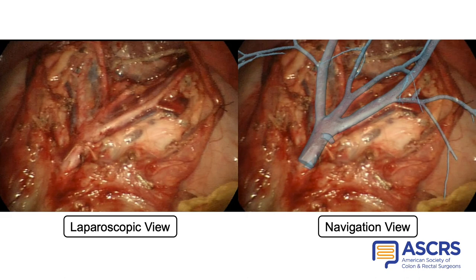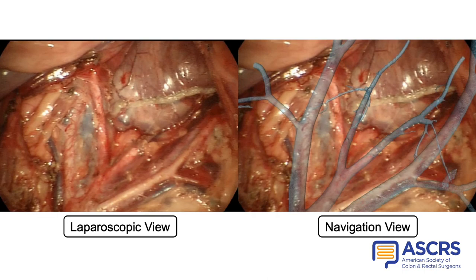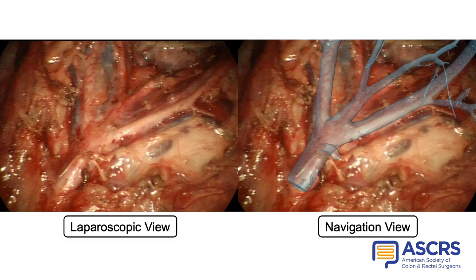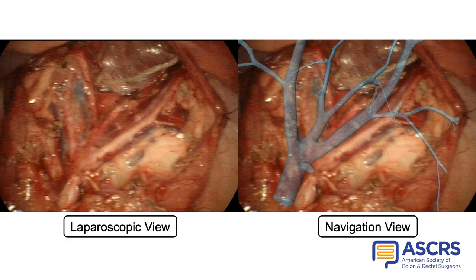This was the view halfway through the surgery. In the case shown in this video, the TRE was 2.1 mm, which resulted in highly accurate superimposed images.